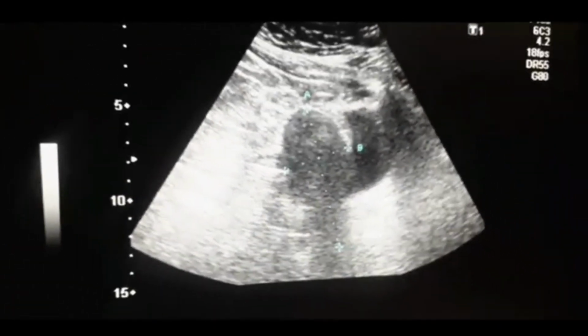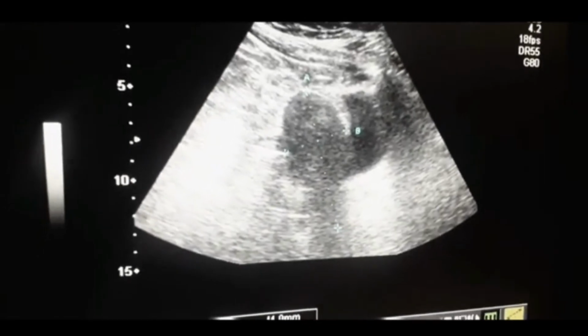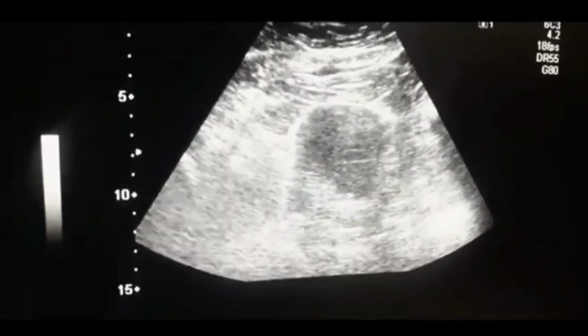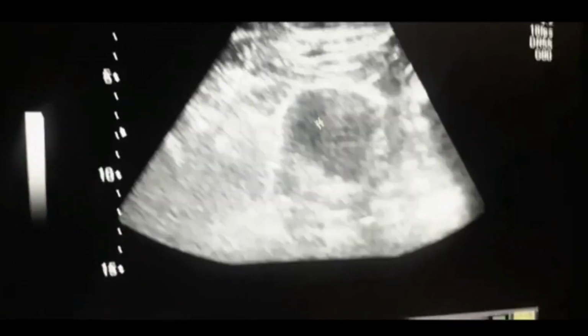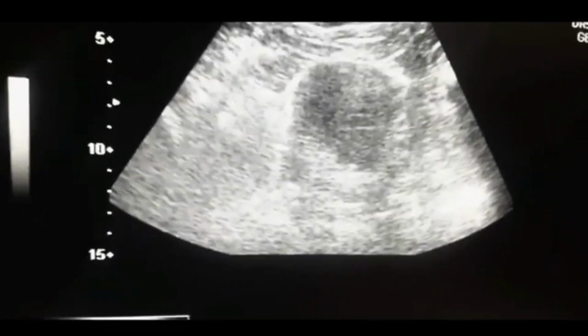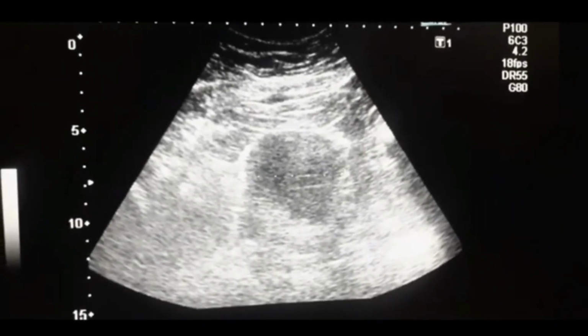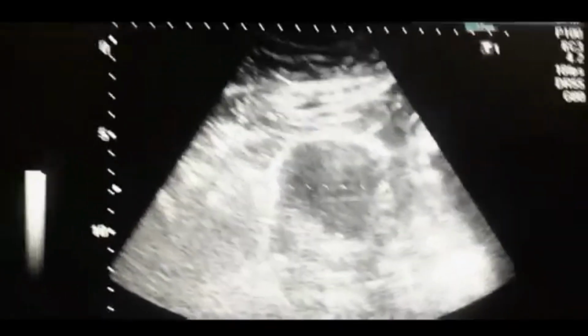You can see the bladder in front of the uterus. So this is the normal anatomy of the uterus. You can see the ultrasound picture of the uterus.